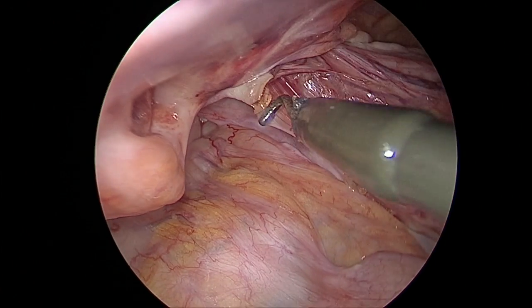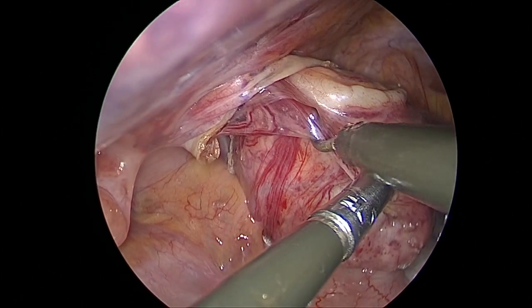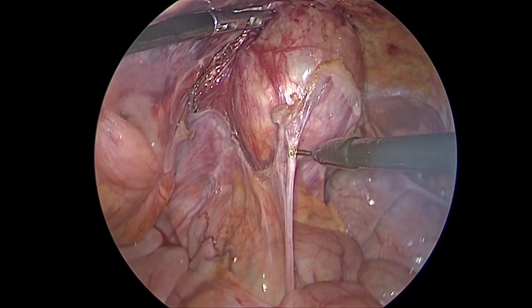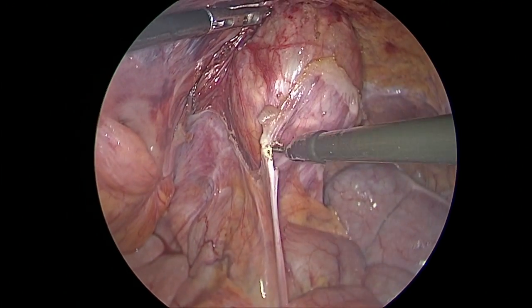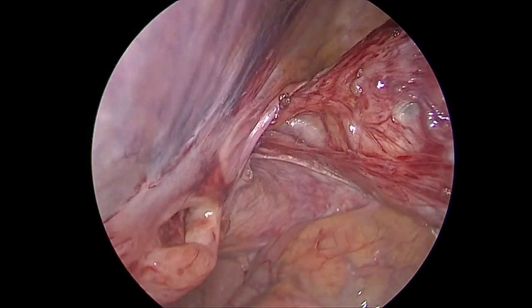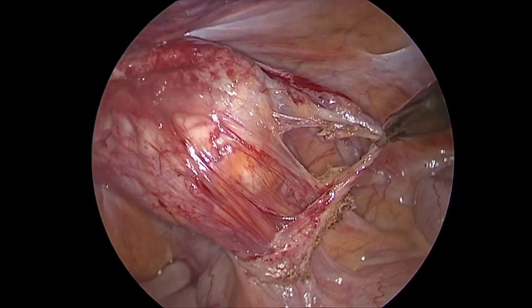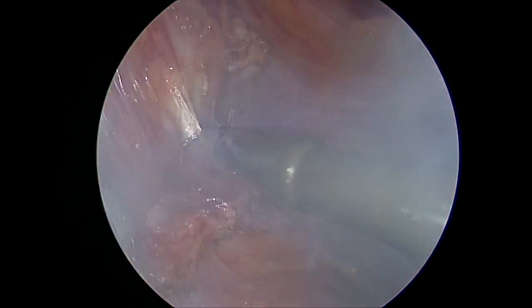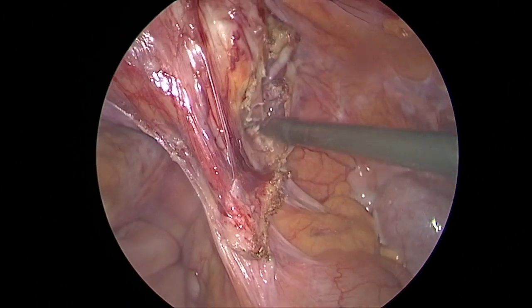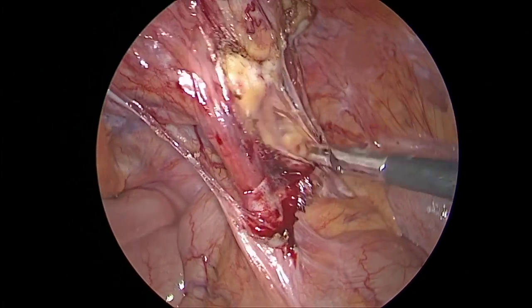Having dissected the peritoneum off on the superior aspect, what I saw was there were enlarged lymphatics in this area, and probably this was a cyst which was originating from the lymphatics, and you can see the large lymphatic channels. Having dissected the cyst superiorly, inferiorly, all that remained was the enlarged lymphatics which were feeding it and were exiting the cyst.